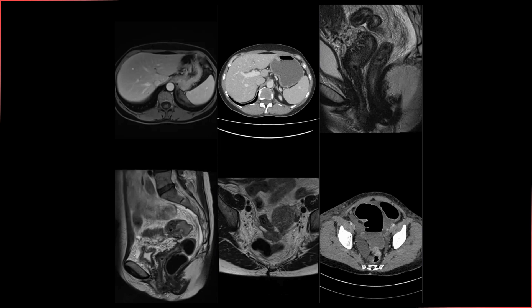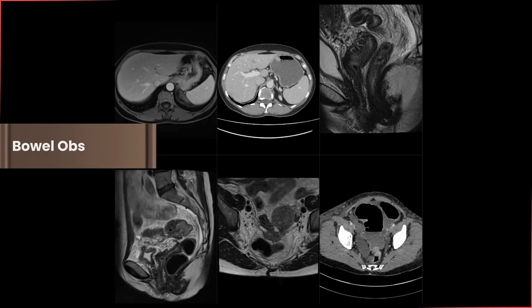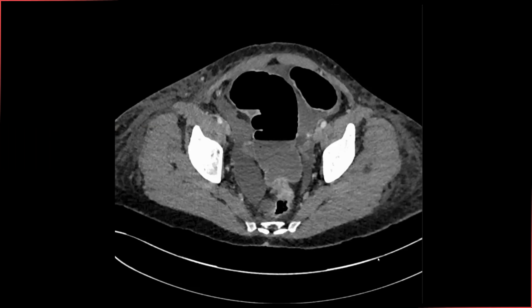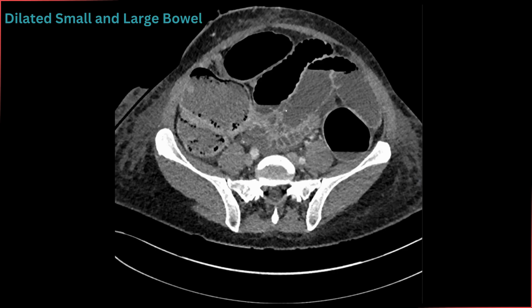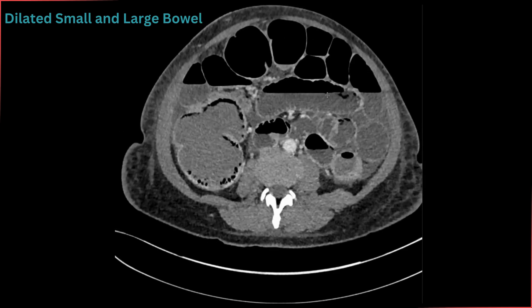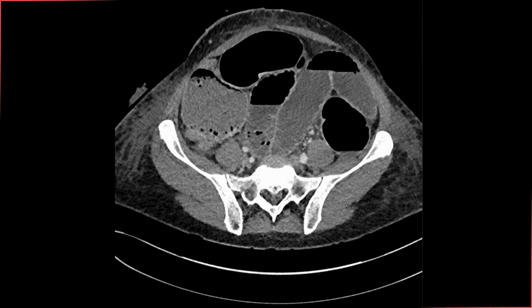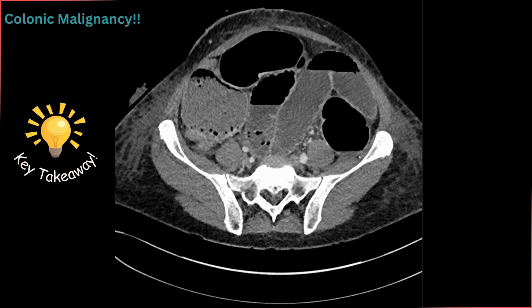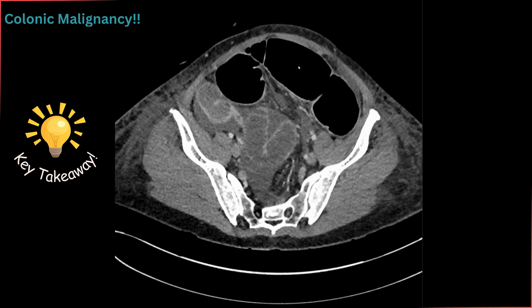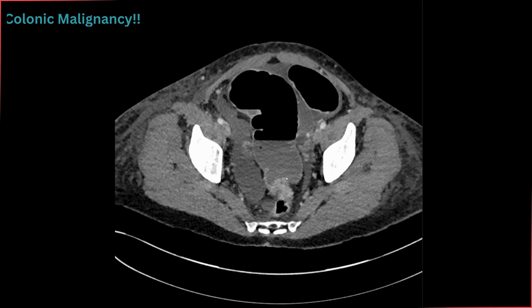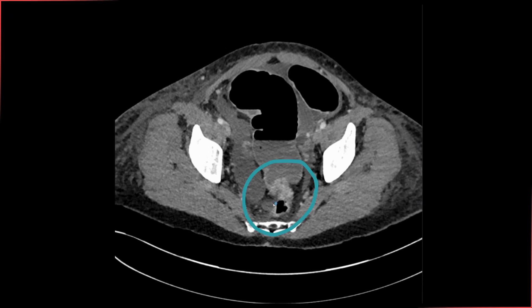Before getting into the details, let me give you some background information about this patient. This patient presented as an emergency with signs and symptoms of bowel obstruction. The CT scan performed on that occasion showed dilated small and large bowel loops. When both are dilated, we try to find the transition point in the colon, and in elderly patients the first concern is always malignancy. You can see the dilated sigmoid colon, and following it down to approximately the rectosigmoid junction and upper part of the rectum, there is an irregular short segment stricture showing clear nodularity and enhancement — highly concerning for malignancy, which is exactly what it turned out to be.